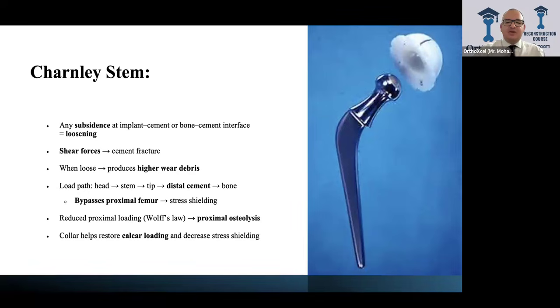His idea, because he was using a cemented cup, is that when you use a small head, the shear movement that goes with the movement of the joint is less from a small head, so there is less shear on the cement-bone interface behind the cup. So he thought that with a small head he was achieving low friction, and this low friction means fewer shear stresses moved from the moving part to the cement-bone interface, and this achieved for him a long-life implant or reduced loosening.